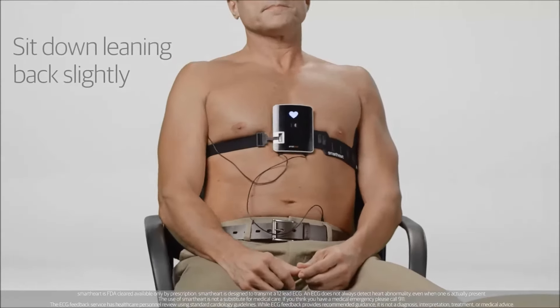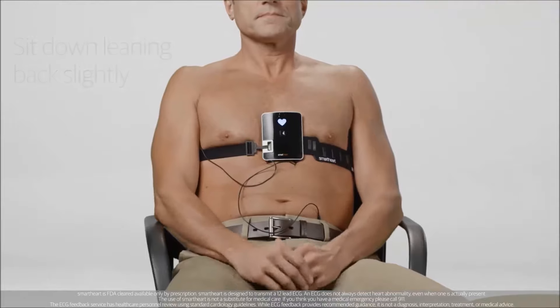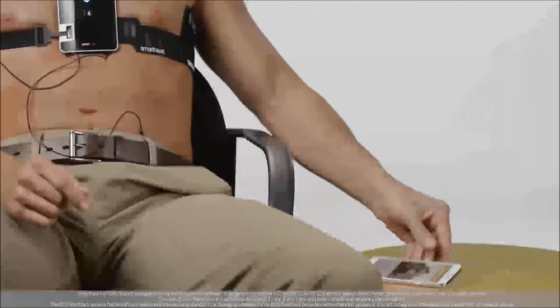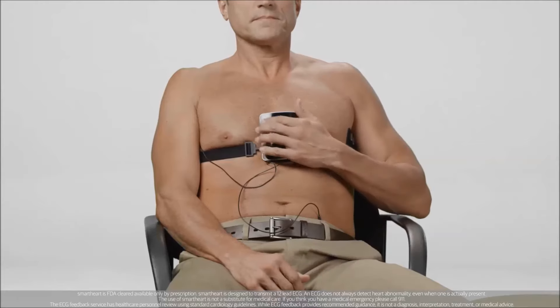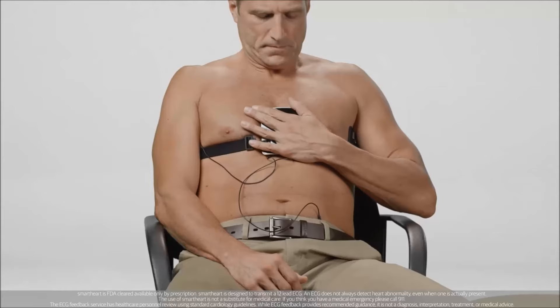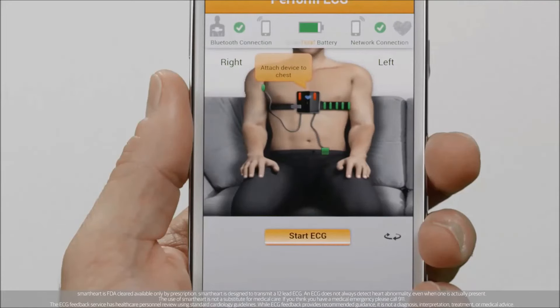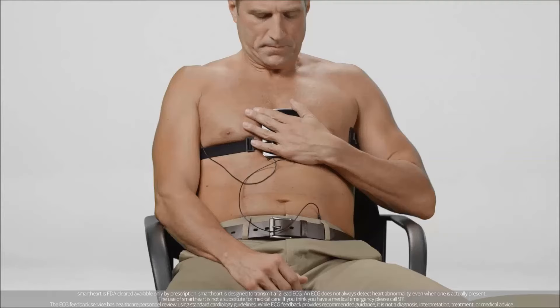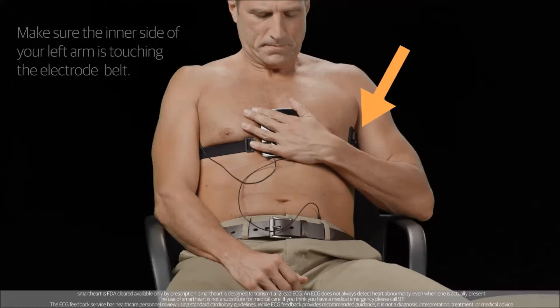When you're ready, sit comfortably and rest both of your hands in your lap. Be sure to place your phone flat on the table for the duration of the test. If the chest electrodes in the app appear red, check that the device is still flat against your skin with your left hand. If the electrodes return to red every time you remove your hand, transmit your ECG while holding the device to your chest with your left hand. It's important to make sure the inner side of your left arm is touching the electrode belt before starting.